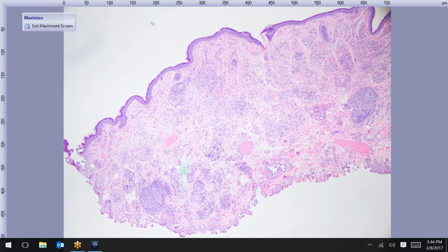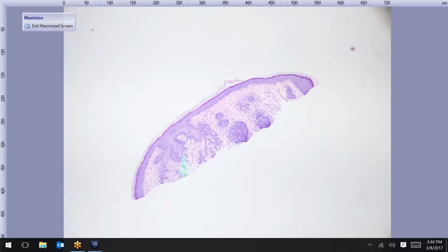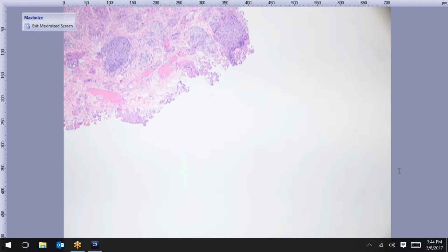All right. We'll go on to the next one here. If anybody's having any issues with hearing me or any kind of problems, just feel free to type it. Oh, just one second. What features clue you in? Okay, I'm just looking at this. What features clue us in that it's on the eyelid? And let me show you that.